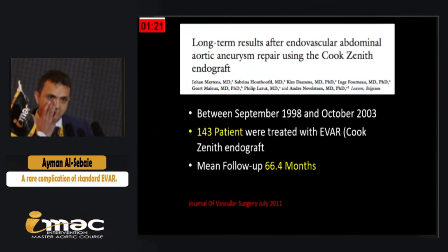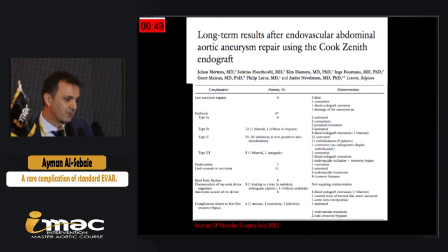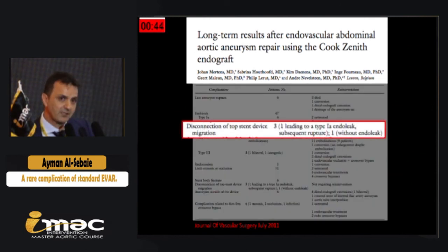So we looked in the literature after we saw this. For me, it was the first time I saw this, and I have a very long history with EVAR. There was one publication in 2011 reporting long-term results after endovascular abdominal aortic aneurysm repair using the Cook Zenith endograft. They report that 143 patients were treated with this device, and the follow-up was 66 months. And in the long-term follow-up, they found only 3 patients with a disconnection of the top stent device.